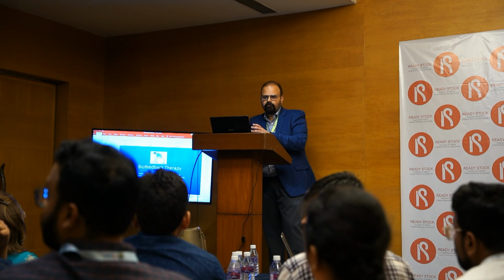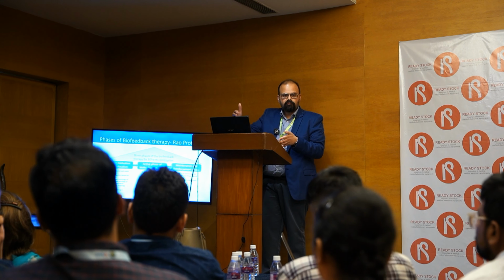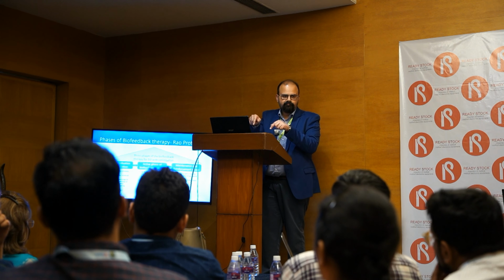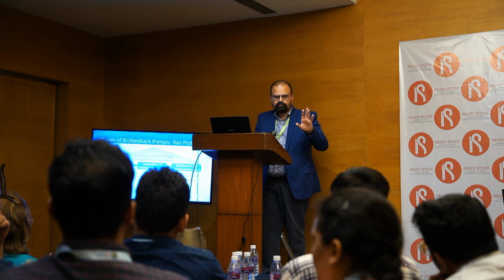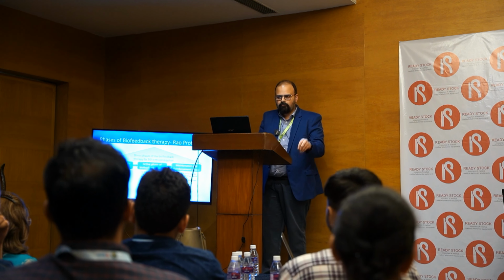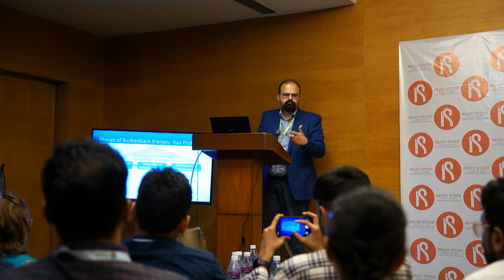So I'll skip the indications. You all know what are the indications of biofeedback and what are the goals of biofeedback. So Dr. Rao originally gave the original articles on biofeedback therapy. He gave it in three phases. The first is the patient evaluation phase, then you have the active phase, and then you have the maintenance or the reinforcement phase. What we usually talk about sessions is the active phase or the in-between one. The patient evaluation and education usually we had already done in our OPD settings when we are doing manometry.